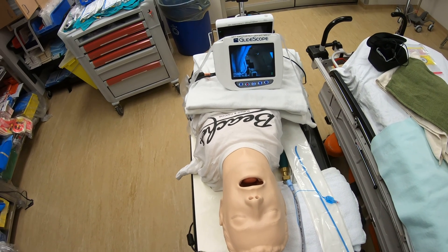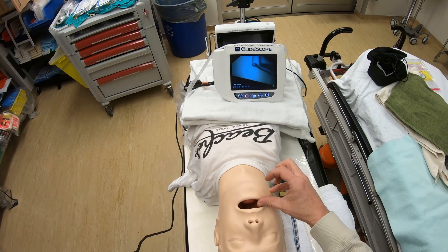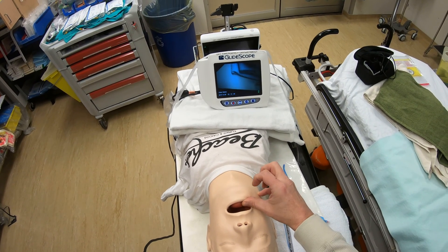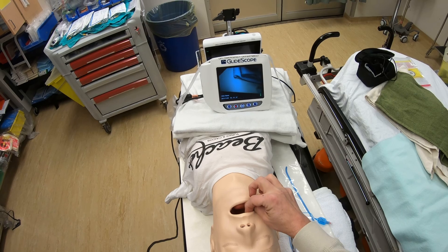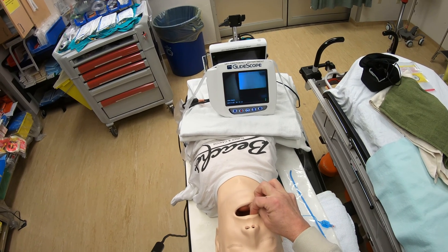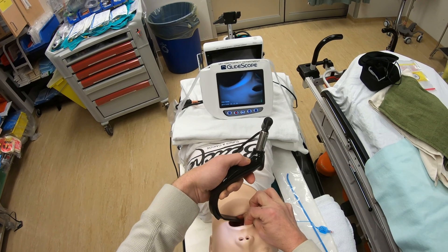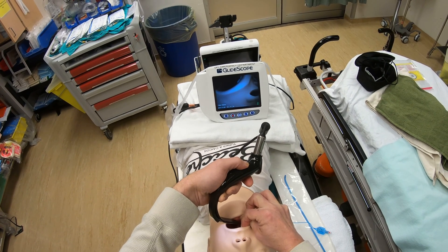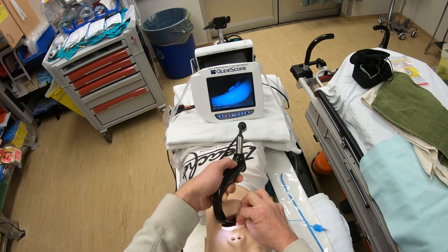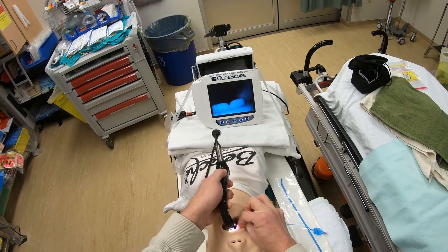Let's proceed. I always begin with proper mouth opening — cross-finger mouth opening. Push on the corner of the mandible, the mandibular teeth, then cross-finger stabilize over the maxillary teeth. And then always routinely enter with your blade obliquely. That way the handle is never going to hit the chest of a patient. Don't wait for that to be an issue — just do it routinely.